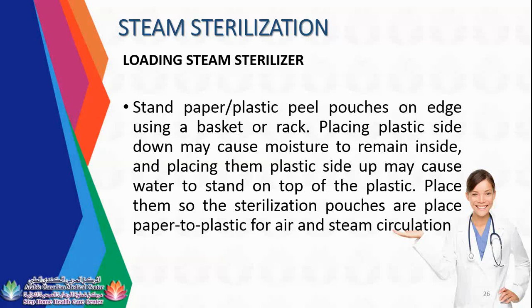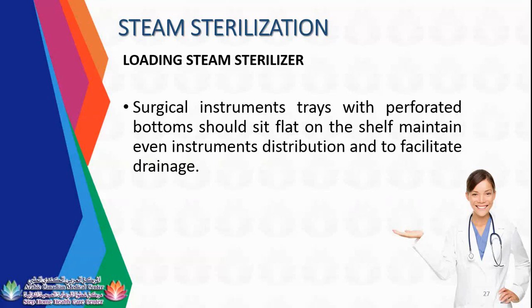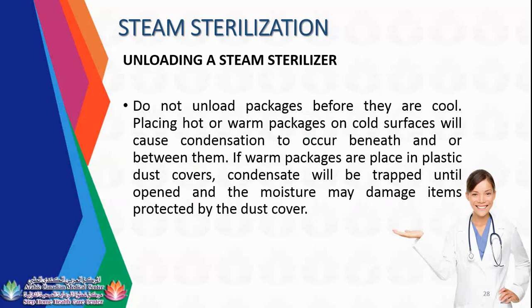Surgical instrument trays with perforated bottoms should sit flat on the shelf to maintain even instrument distribution and to facilitate drainage. Do not unload packages before they are cool. Placing hot or warm packages on surfaces can cause condensation to occur beneath and between them.